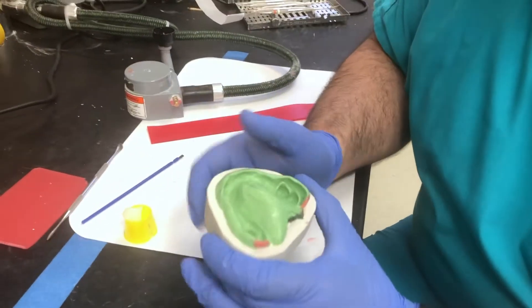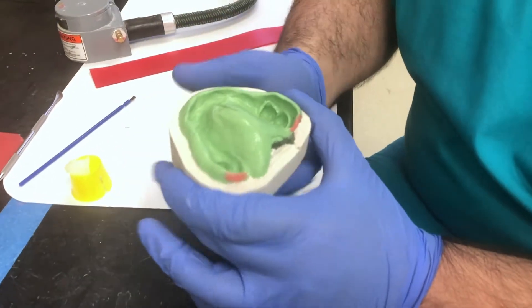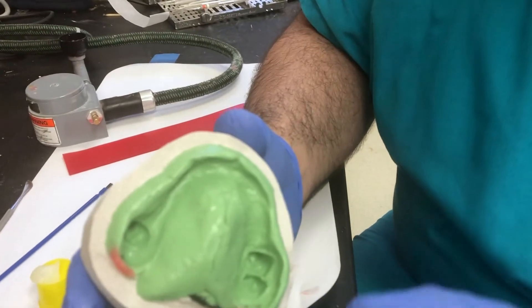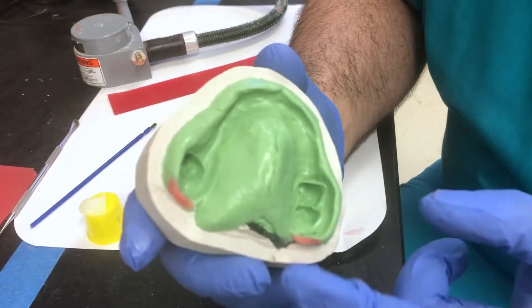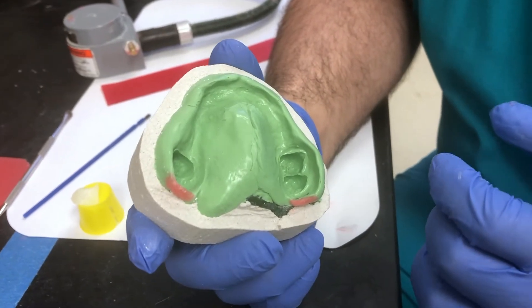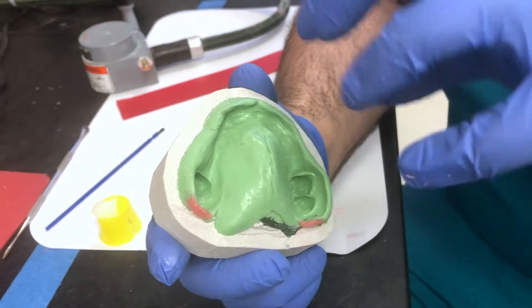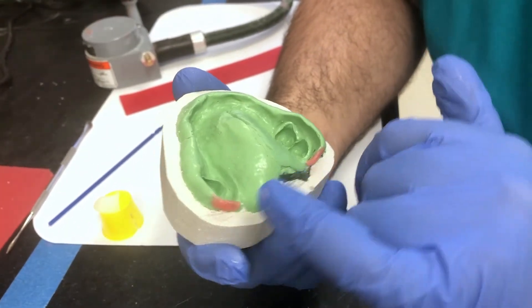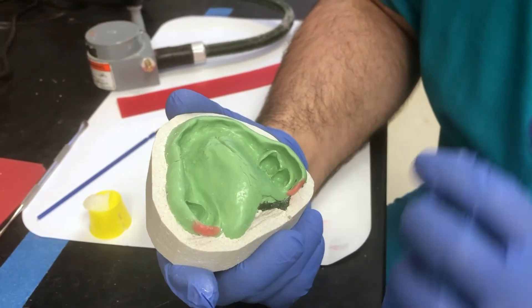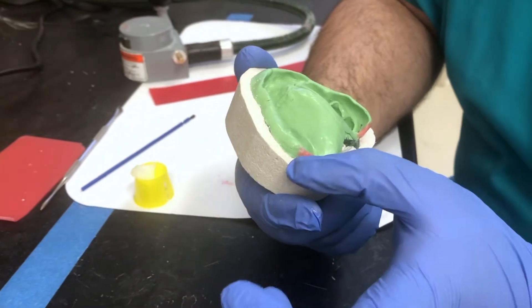After trimming, if there are any areas that are really thin, it's always recommended to add a little bit of wax to thicken them up. I had thin areas here and here, so I added some wax and made it thicker. It's going to be much easier to get a wax record base and wax rim — when you do the pink record base material or the acrylic, it'll be easier to get it back there. You won't have to trim away the stone, and it's not going to interfere with anything.